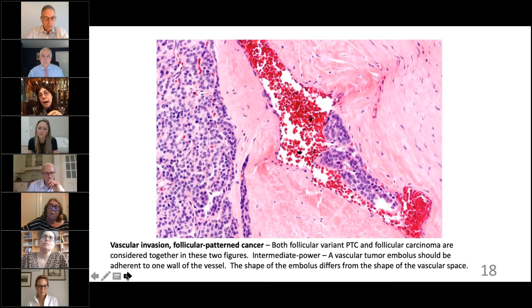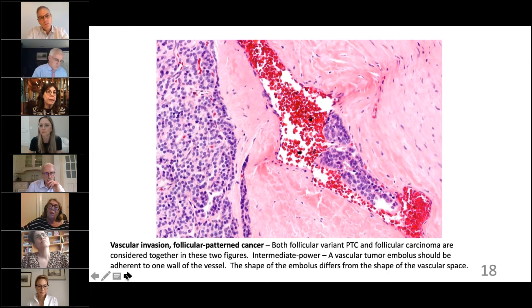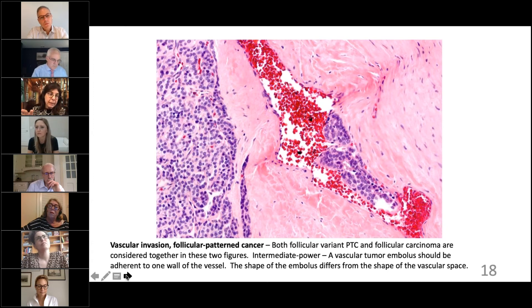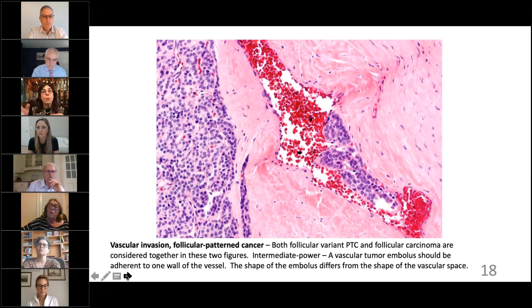The emboli are basically stuck onto the wall of the vascular space, and the shape of the emboli is very different from the shape of the vessel. That's important because more often what we really see is retraction artifact. The reason for discrepancies between pathologists — if one person says yes and another says no — is that there may be an over-reading of retraction artifact.